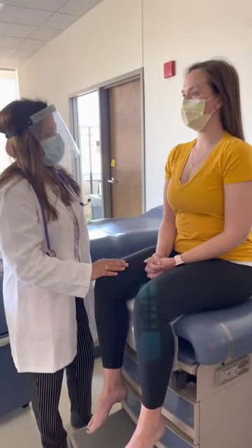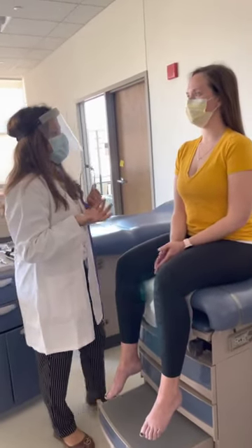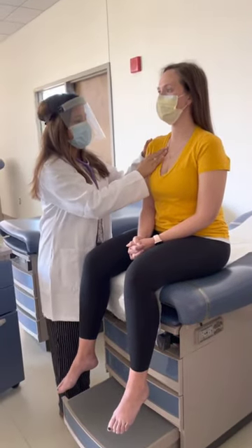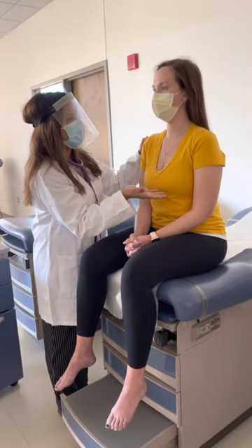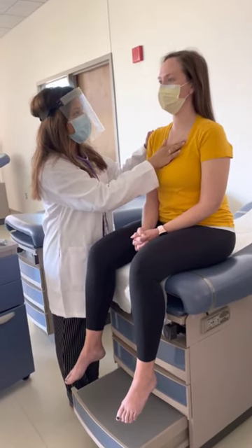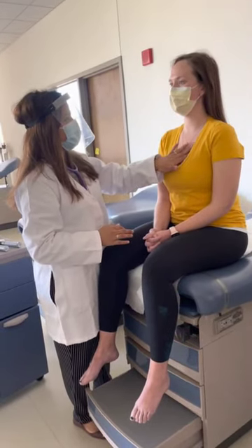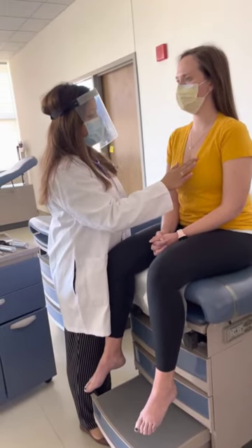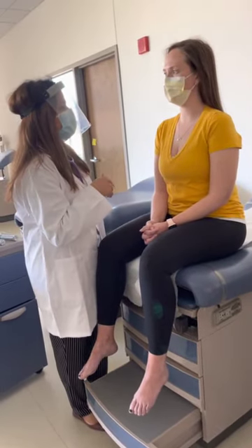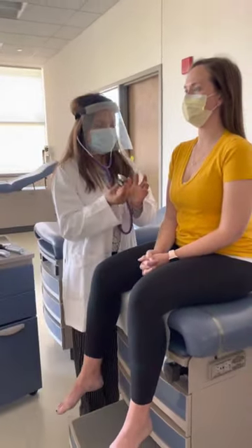Next I'm going to auscultate for heart sounds and murmurs. The five points are: aortic — second intercostal space, right side; pulmonic — second intercostal space, left side; Erb's point — third intercostal space, left sternal border; tricuspid — fourth intercostal space, left side; and mitral — fifth intercostal space, midclavicular line. I'm going to listen to those points using the diaphragm.